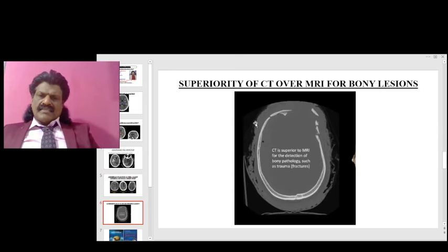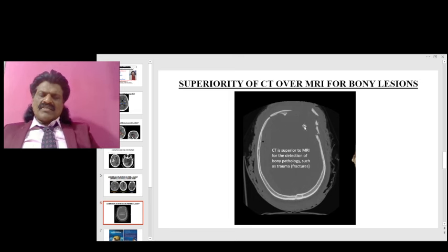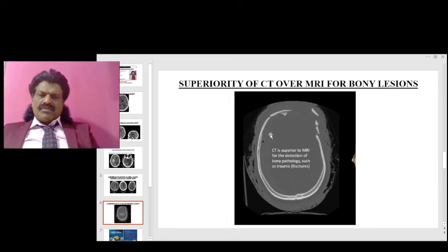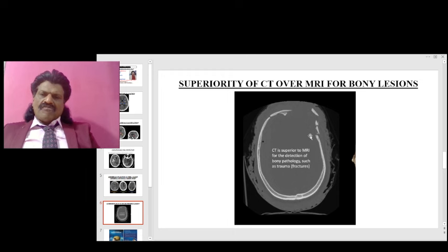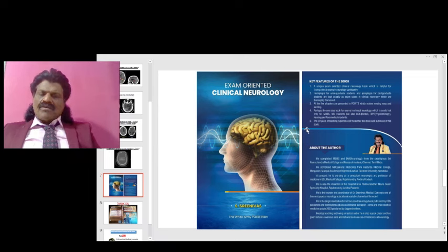CT scan is superior to MRI for bony lesions — here you can see fractures clearly. CT scan is the first-line modality for stroke as it helps rule out hemorrhage to enable thrombolysis. In head injury, subdural hematoma or extradural hematoma — being hemorrhagic — is easily picked up. CT is superior to MRI for bony pathology, and any fracture or bony involvement can be readily identified.